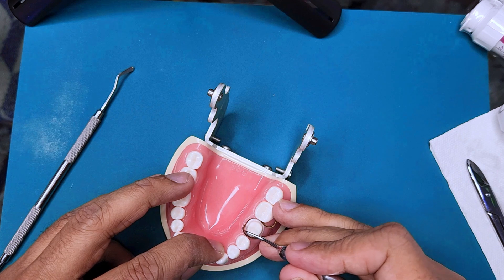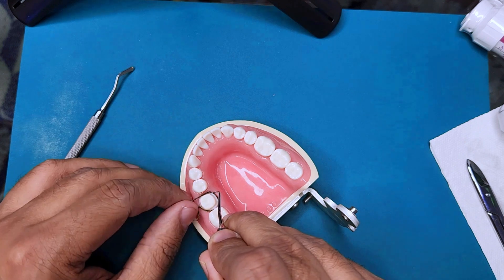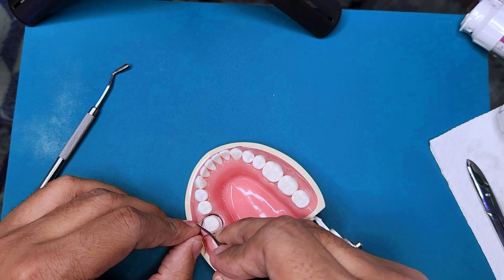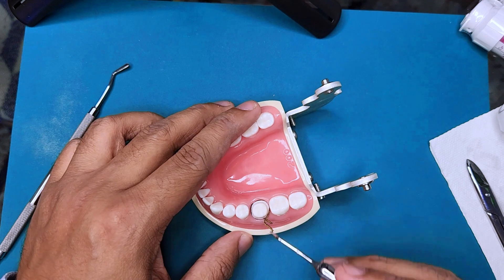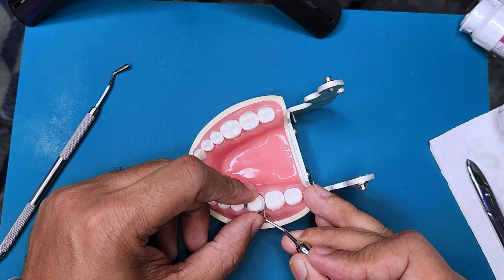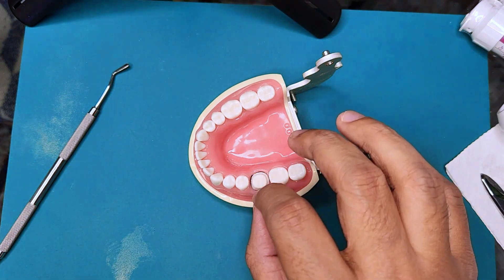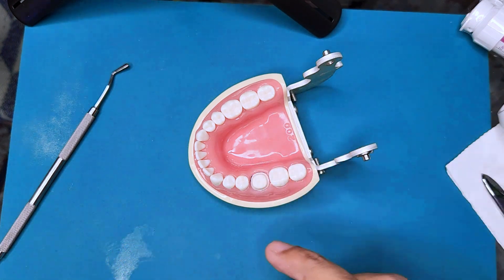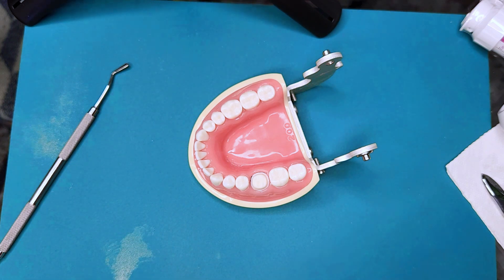There are also two other forces to remember: the collapsing force and the pressure applied by the impression material. The moment you remove the cord, the tissue starts to collapse — the time it takes is less than 20 seconds. So make everything ready before pulling the cord out, and ensure the impression material goes into the mouth within 20 seconds. These days I have moved to scanning preparations, so there's no collapsing force from impression material acting on the tissue.